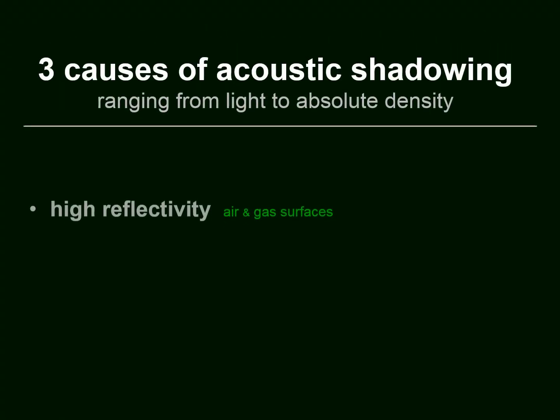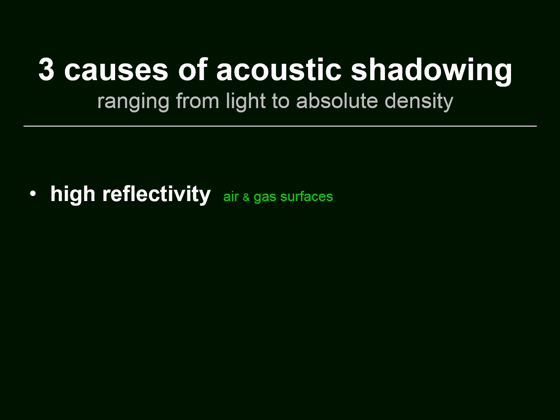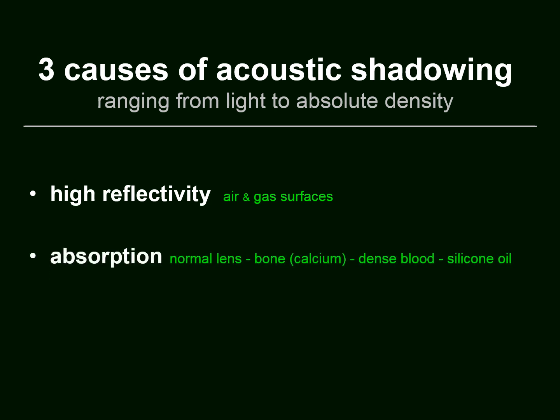There are basically three causes of acoustic shadowing, ranging from light to absolute density. High reflectivity is one, high reflectivity at air and gas surfaces. Absorption is a frequent one. The normal lens or bone, calcium deposits, dense blood, silicone oil, they all absorb much energy and can cause acoustic shadowing.